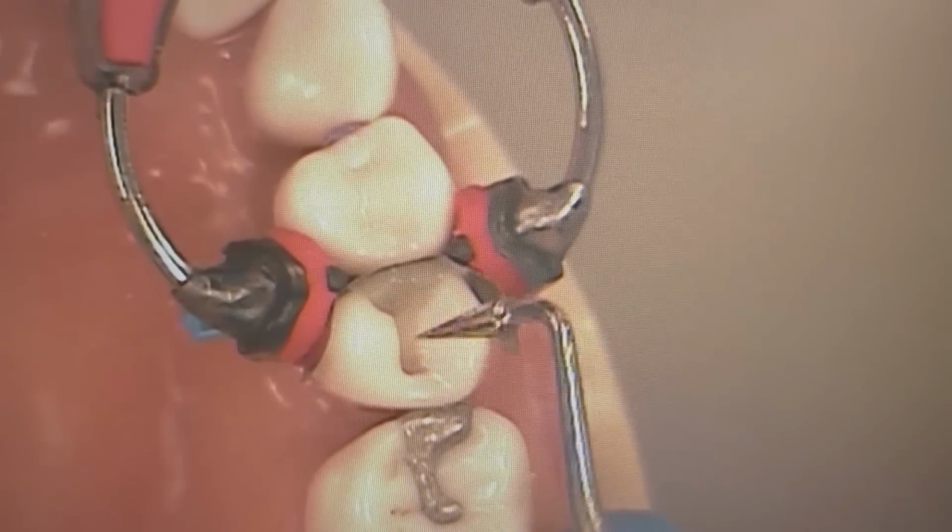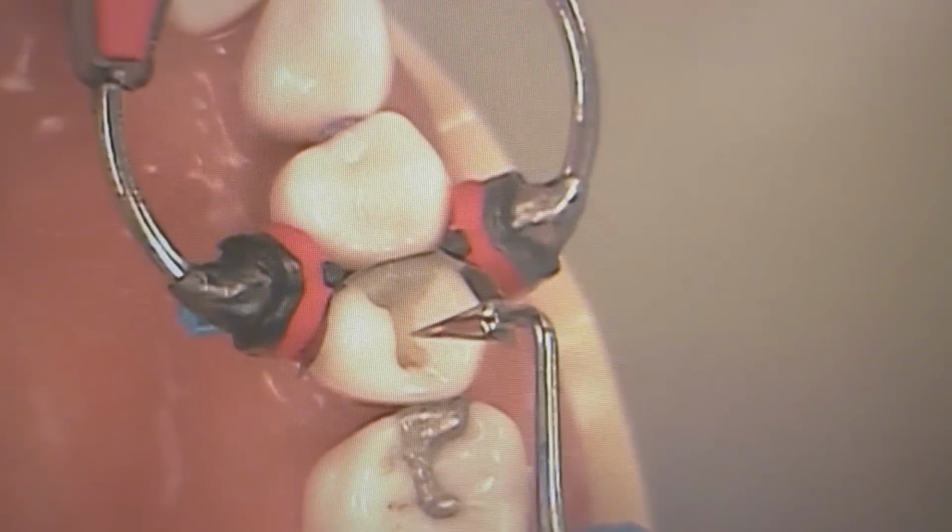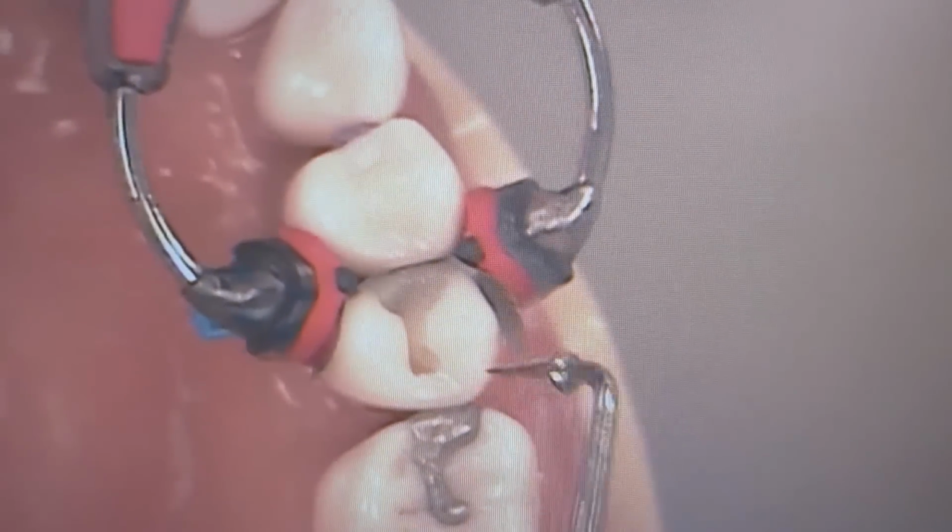It's a hot dog like this on top. Like a hill. So when you're dragging it like that, are you worried about open margins? No, so I'm dragging it from the restoration to the margin. Okay, so you're dragging from restoration into the margin.